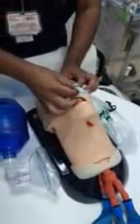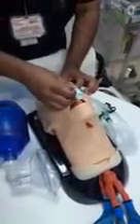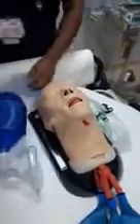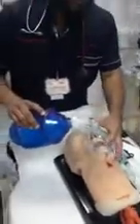There are contraindications to passing the nasopharyngeal airway, which may include facial trauma and facial burns. If it is not going inside or you are having difficulty, you have to remove it and then start with bag valve mask ventilation.